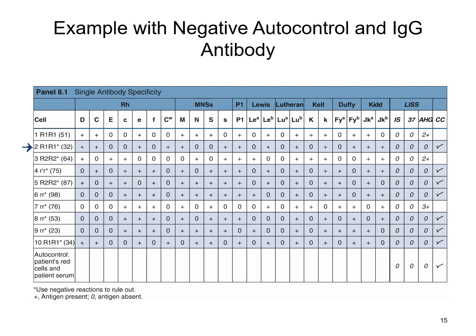That means that they are what blood type? That means they're O positive, because remember, these are all O donors. And then we also have our RH phenotype listed here. So R1, we know that that's got to do with all of this RH phenotype. We talked about that with RH nomenclature.